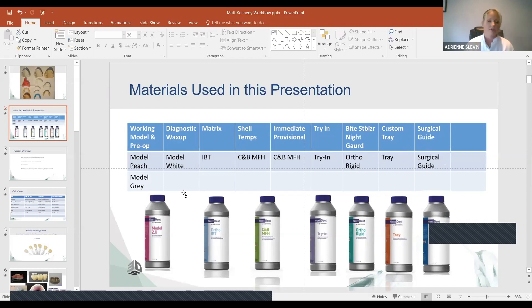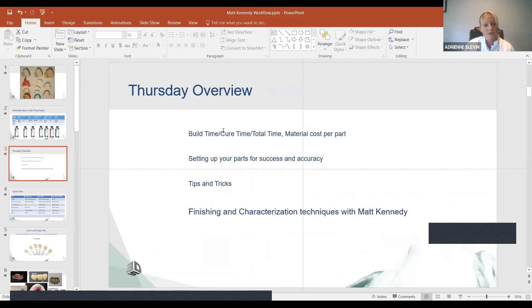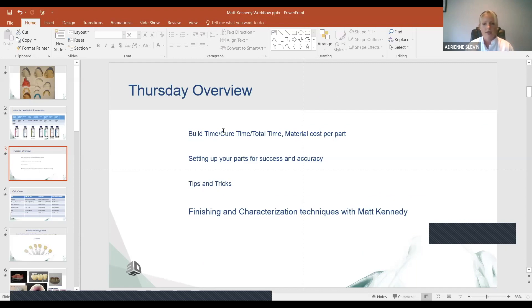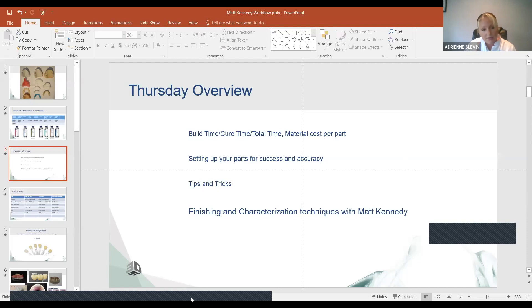Today Adrian will show a few nesting techniques and tips briefly. Tomorrow she'll go more in depth on build time, cure time, total time, material cost comparisons versus milling, and setting up parts for success and accuracy. She notes that many of the same rules apply regardless of which printer you're using. After her section tomorrow, Matt will show how to design everything, and Adrian will show how to nest, finishing with Matt demonstrating aesthetic characterization.